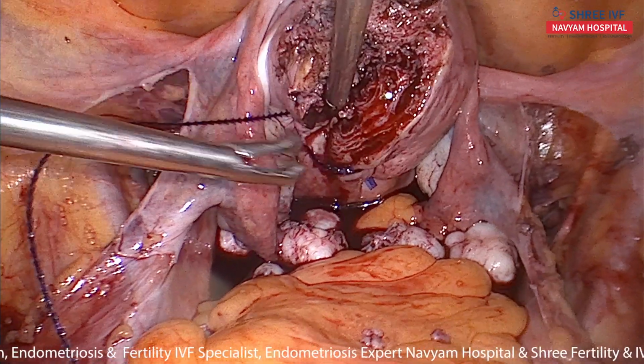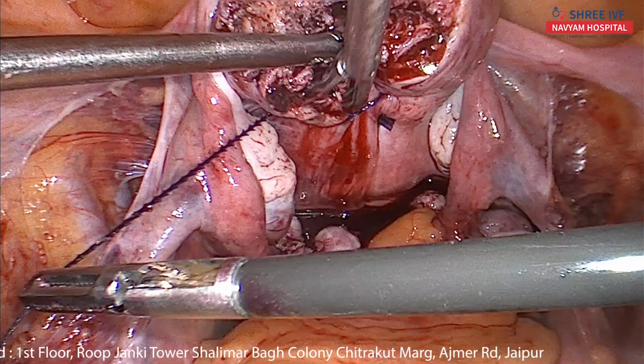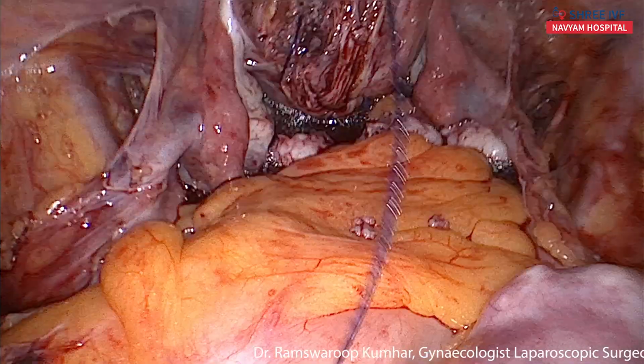I am trying to put this knot at the angle of the incision. Looking a little difficult, I think. Okay. Good. Thank you, Lokesh.